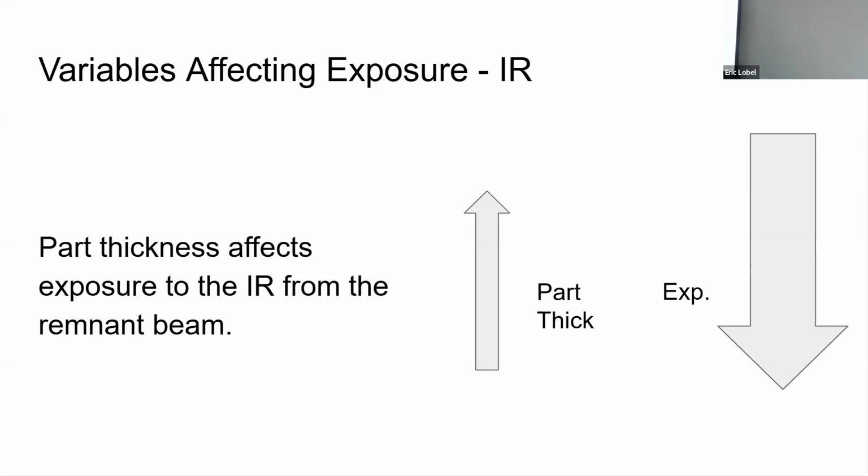I'm sorry, just for clearer understanding, would there be more absorption in terms of photoelectric? If you have a higher atomic number, it appears more whitish. So in this case, will it change if we have more absorption? Oh, okay, I see what you said.